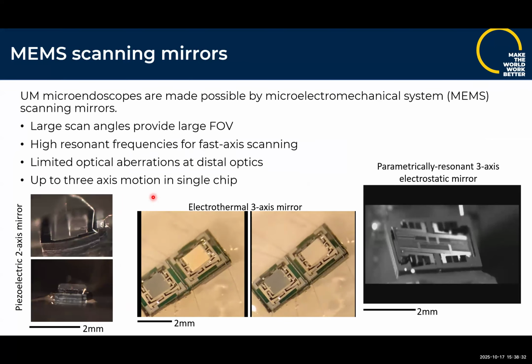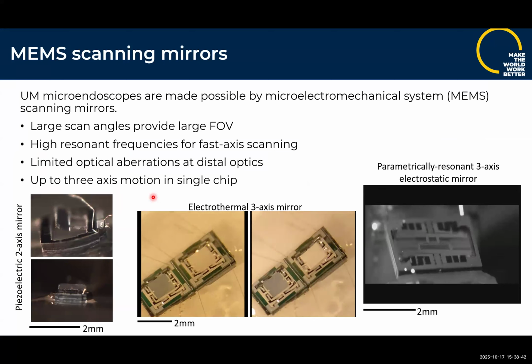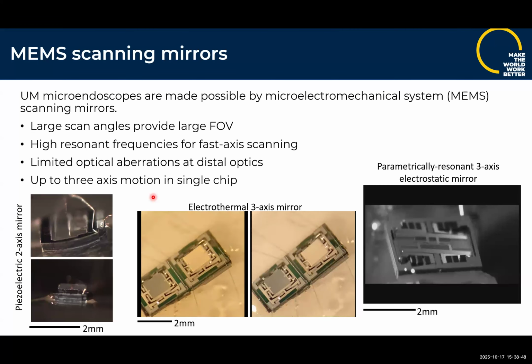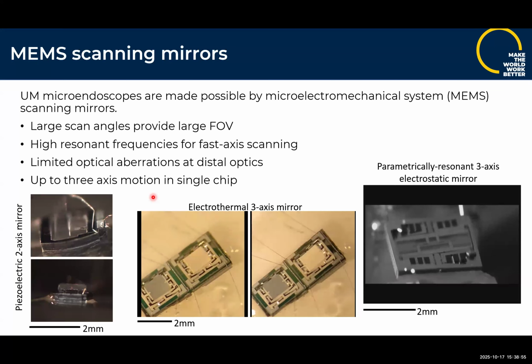Each of these micromirrors shown up here consists of a chunk of silicon that was originally part of a silicon wafer, some rigid portion that we've covered with a reflective surface, or sometimes 2 reflective surfaces, and then actuation systems in one or more various configurations around the device in order to drive motion.